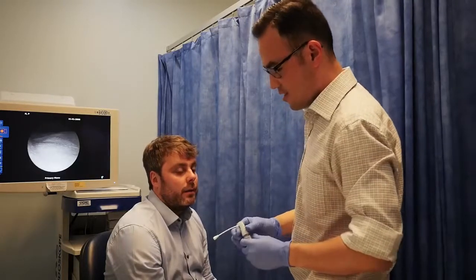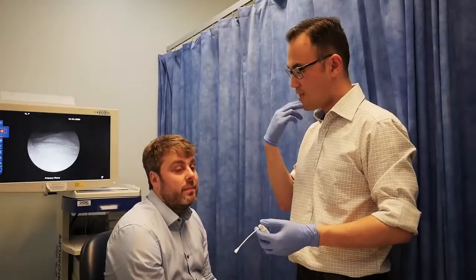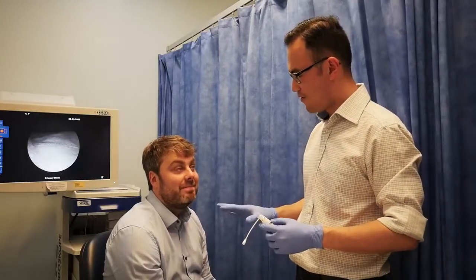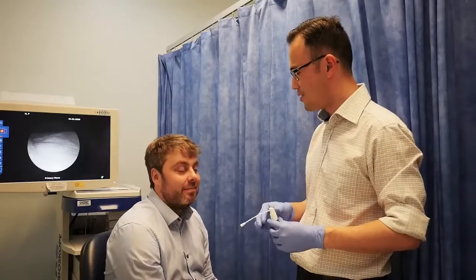It's quite important to tell the patient that a bit of the anesthetic will drip down the nasopharynx into the throat, and it'll numb the throat as well. It's a bit uncomfortable, but it will wear off in about an hour. It's important not to have anything hot to drink until the sensation fully comes back.